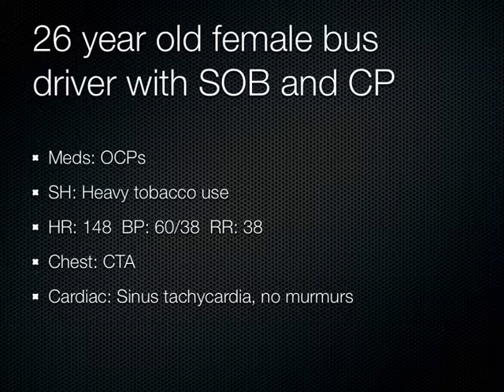What happens? Normally you've got the left ventricle and you've got the right ventricle. The right ventricle is about 2/3 the size of the left ventricle, correct? You with me? Yes. So what happens during a massive pulmonary embolism to cause this derangement of vital signs? So the right heart gets bigger than the left heart.